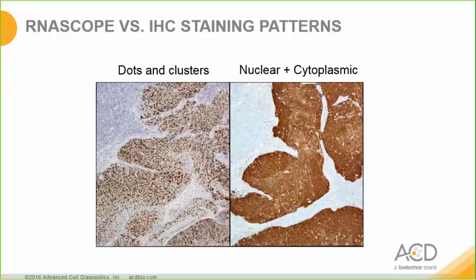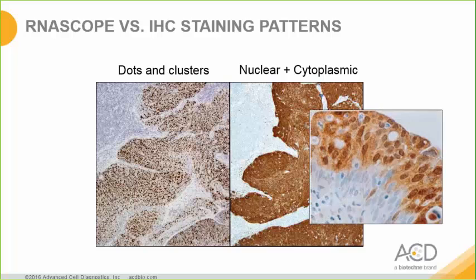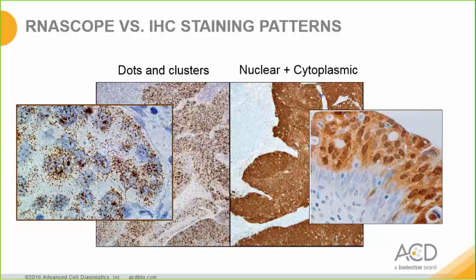These two images show the contrast in staining pattern of RNAscope versus IHC with P16. On the right, with IHC, there is diffuse nuclear and cytoplasmic staining, while on the left, with RNAscope, the signal appears as dots and clusters in the nucleus and cytoplasm.